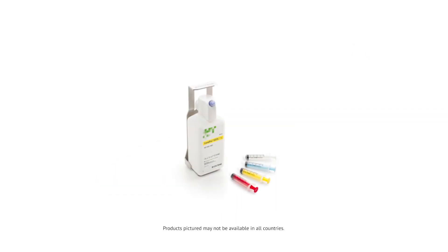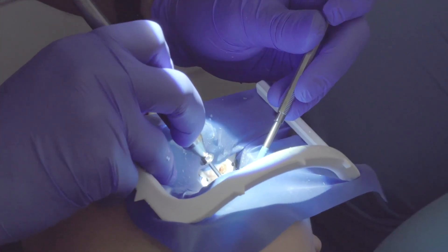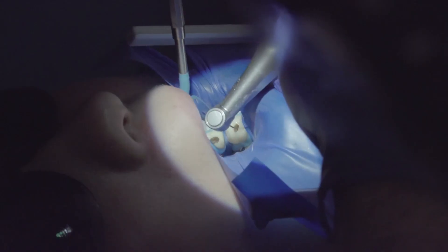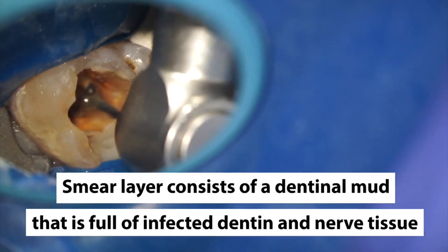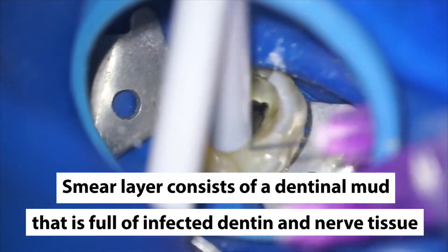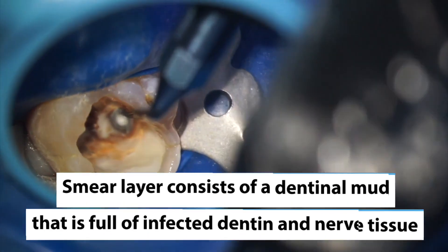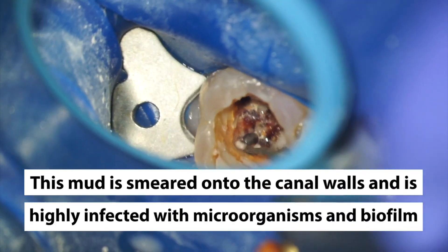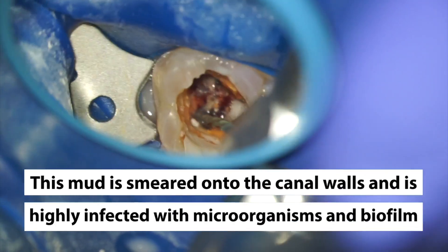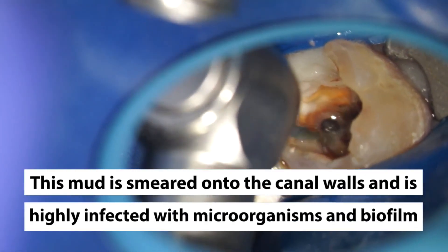During the process of shaping the canal with our hand files and rotary instruments we do create smear layer. Smear layer consists of a dentinal mud that is full of infected dentin and nerve tissue. This mud is smeared onto the canal walls and is highly infected with microorganisms and also biofilm.